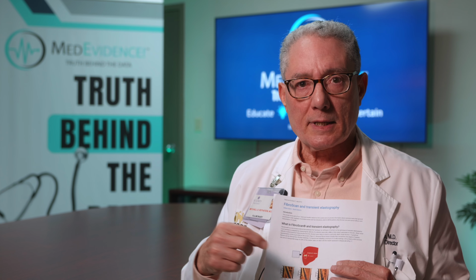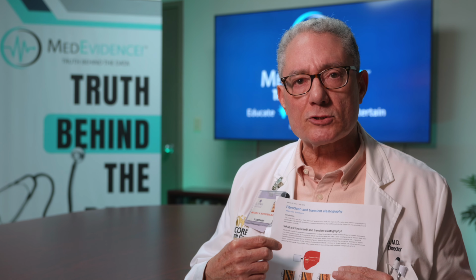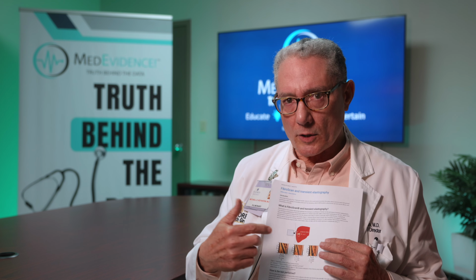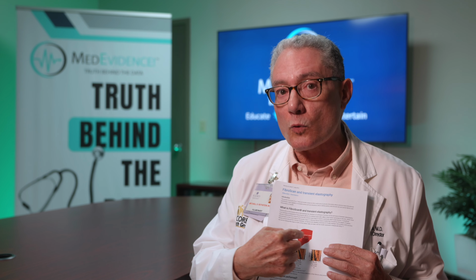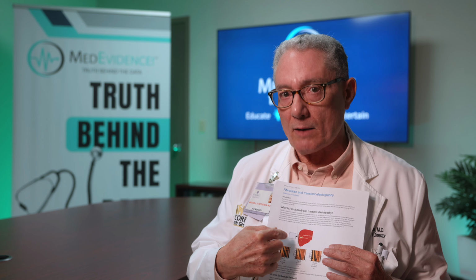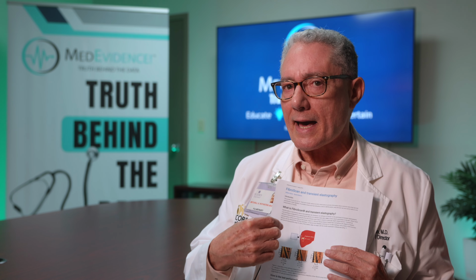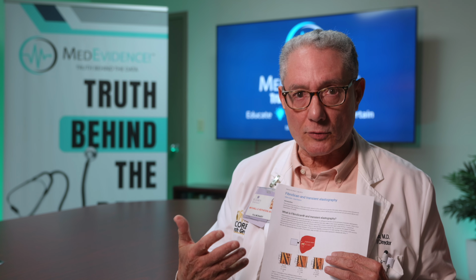The first part, the speed with which it comes back, is a measurement of a capacity of organs in the body called elastography. They're elastic properties. The more elastic an organ is, the more of the waveform is absorbed and slowly returned. As fibrosis and damage occur, the liver stiffens. That causes the waveform to come back more quickly to the transducer probe, and we measure that speed. So that speed reflects indirectly how much damage and fibrosis has occurred in the liver.